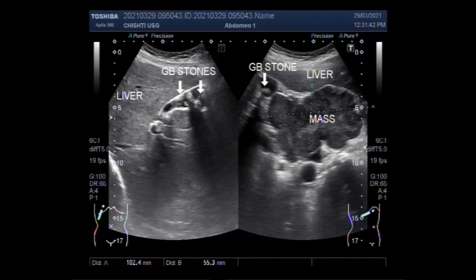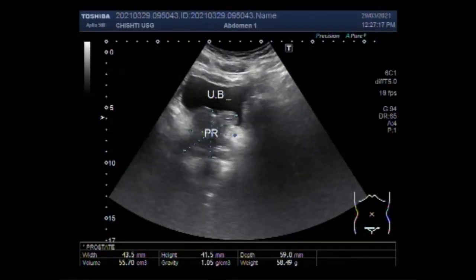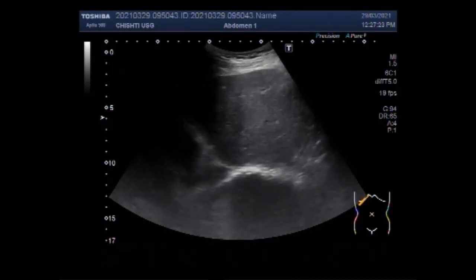Dear viewers, I hope you are all fine. This ultrasound video shows a mass in the porta hepatis, cholelithiasis, and benign prostate hypertrophy, BPH.